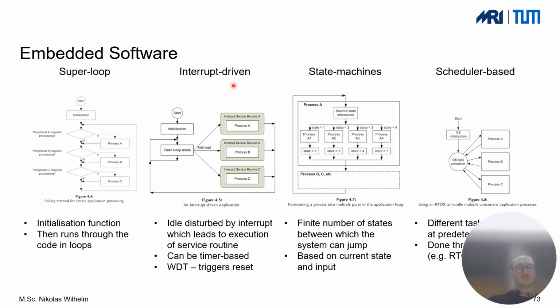One other example is maybe also using an interrupt-driven design. This is a bit more security critical. So maybe some of your sensors will tell you there is a very important event happening. Maybe the force sensor you have connected to your device tells you you have surpassed some threshold. So maybe now you're starting to hurt the patient because you're applying too much force. Then it's very critical to actually react in real time. So for those scenarios, maybe an interrupt-driven software architecture is much better.